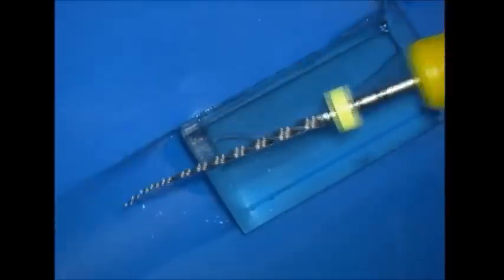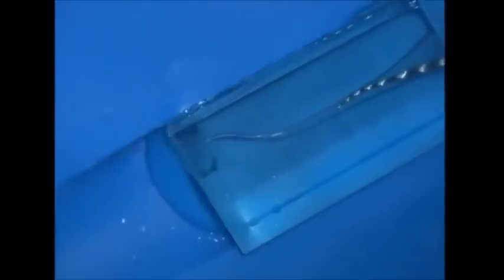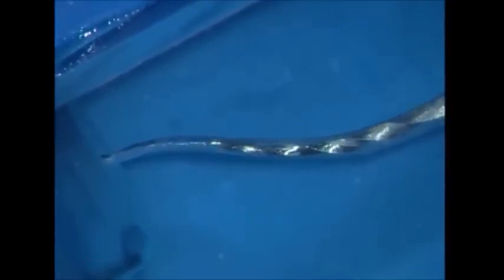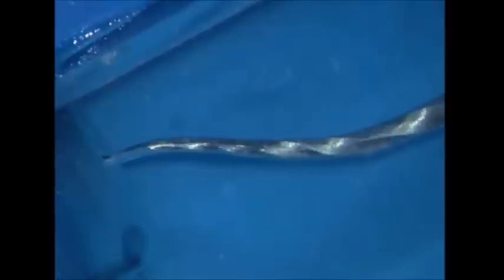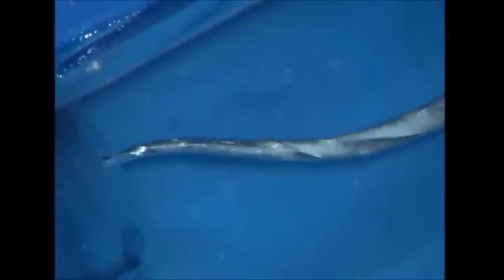Here we use the finisher number 1. Notice again that it's pre-curved, and the pre-curved instrument readily bypasses the ledge. This instrument has a 7% taper in its apical extent, and because of this taper, it very nicely can refine and smooth and eliminate the ledge in its entirety.